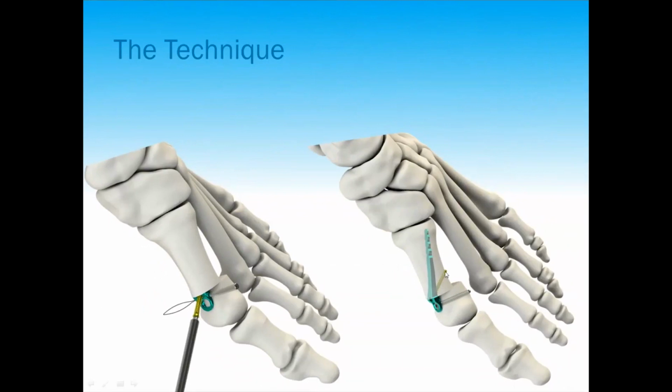So that sets the capital fragment translation, but you want to make sure you get your angulation correct and your rotation. Your angulation typically does not need to be adjusted because it's a flat cut and it sits flat and it doesn't angle on you. But sometimes with larger bunions, larger shift, it may want to angle medial or lateral, and you have to look at that. And then you can get your rotation.